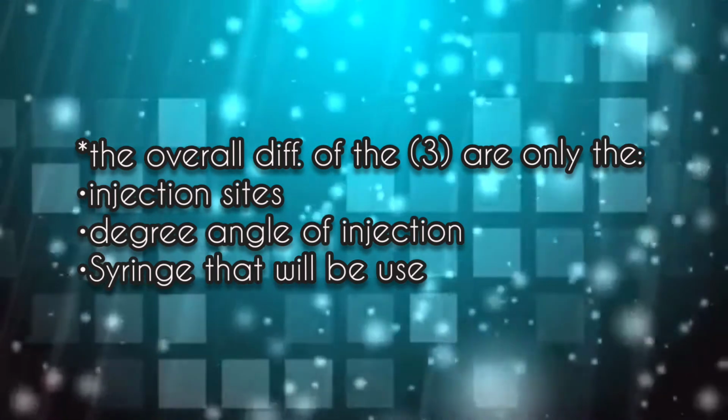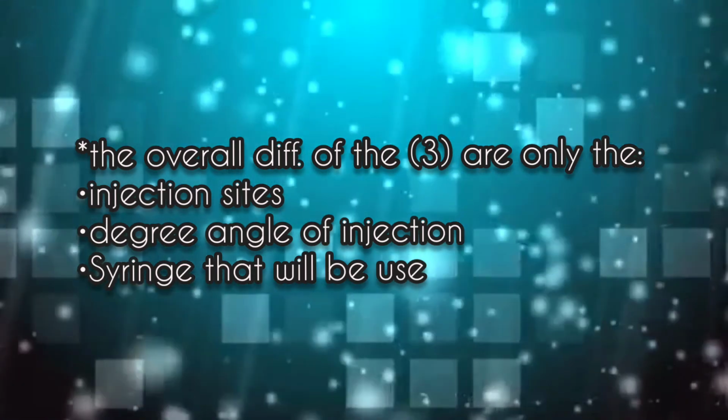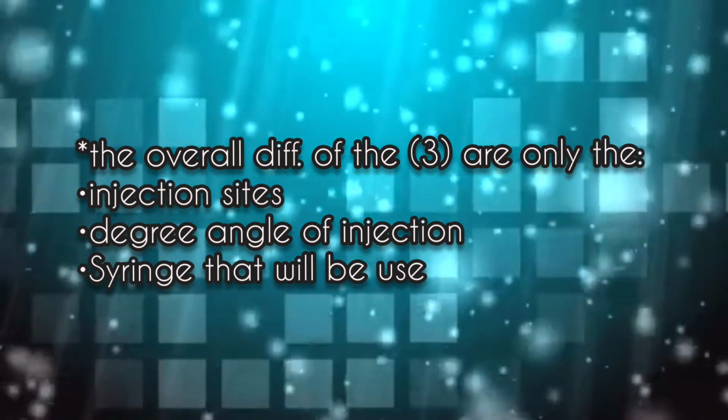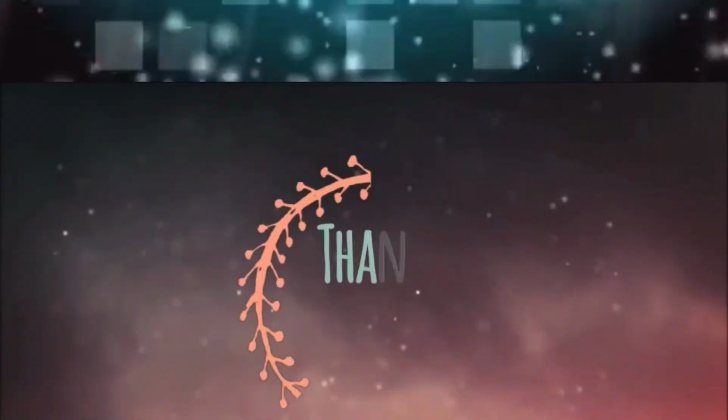The overall difference of the three is only the injection sites, the degree angle of the injection, and the syringe that will be used. And that's all.